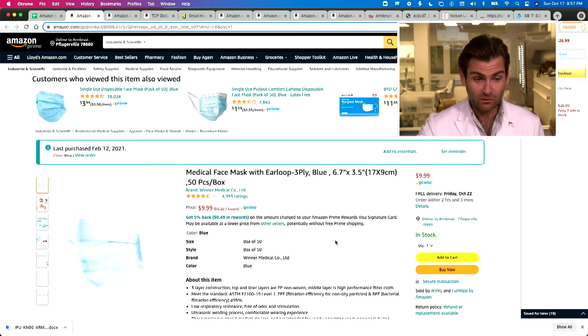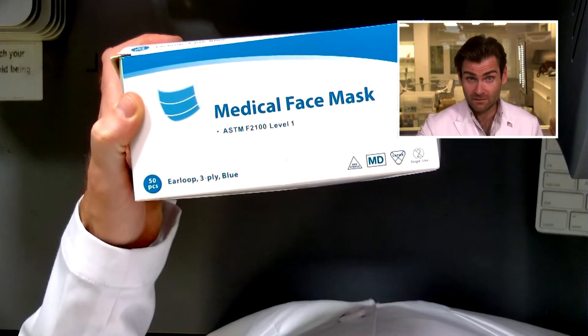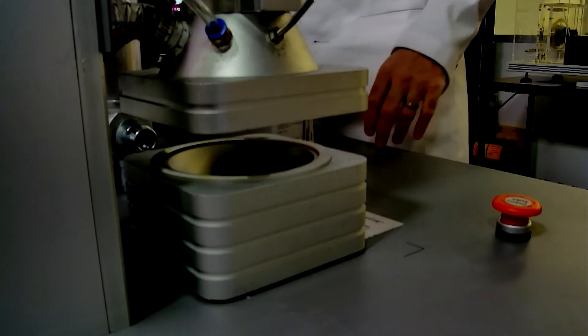Hey there, guys. Welcome back to the place where we're testing every single mask on Amazon, including masks for winners. Looking at the Winners Medical Face Mask. Let's get it in the clamper and see what happens.